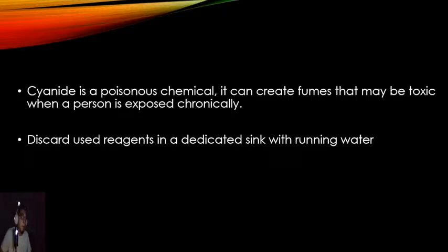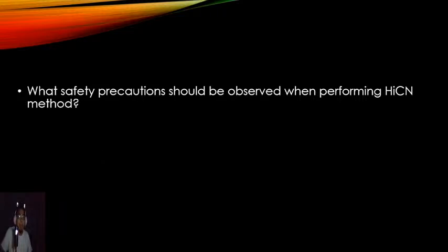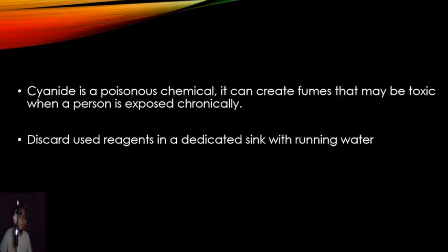All right. That is based on ISO. This particular slide was taken from ISO, as well as the several package inserts that I have received from Abbott as well as from Beckman Coulter. I've worked with several machines that do automated hemoglobin analysis, of course. And usually, this is how we discard the sample: a dedicated chemical sink with running water. All right. Cyanide is poisonous, guys.